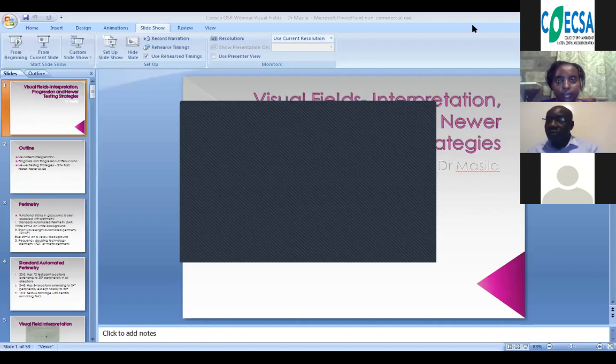But basically, OCT, as I said, the patients who have a CDR of 1 don't really need an OCT because they have glaucoma for sure. At the other end of the spectrum, if somebody is absolutely normal, your cup-disc ratio is 0.3, your visual field is normal, you don't need an OCT.